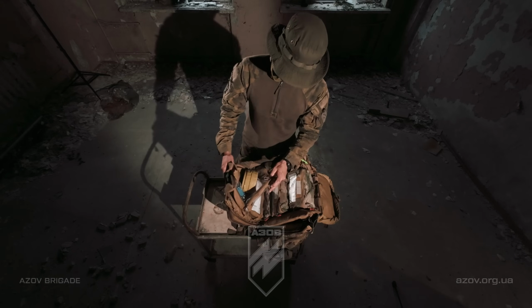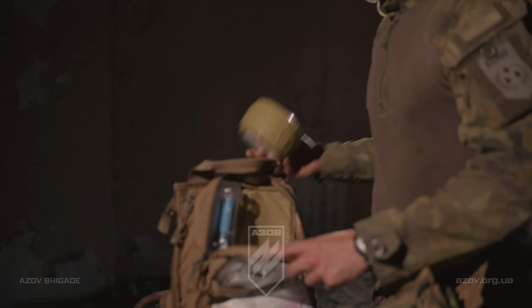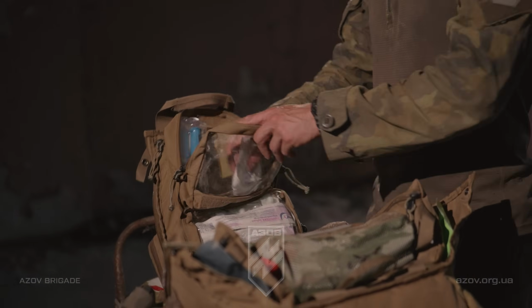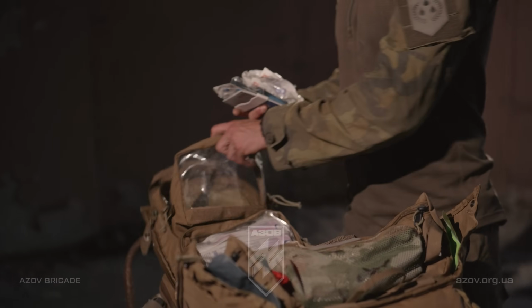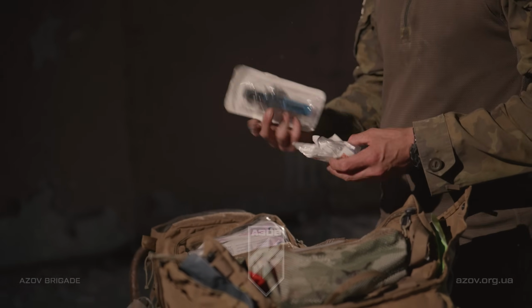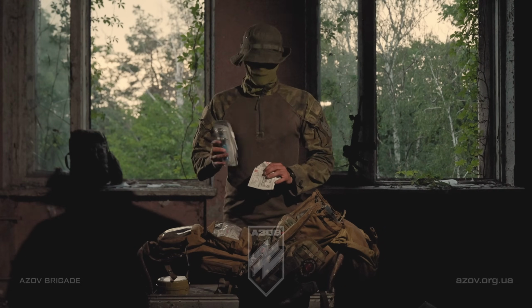In this top bag, or pouch, sorry, I have my pocket BVM. Very, very handy. Luckily I haven't had to use that yet, which I'm very fortunate for. It sucks once you use that, you have to stay with the casualty. So here I have an EZ-IO and 2 lines. I'm not going to lie, I'm a big fan of this.